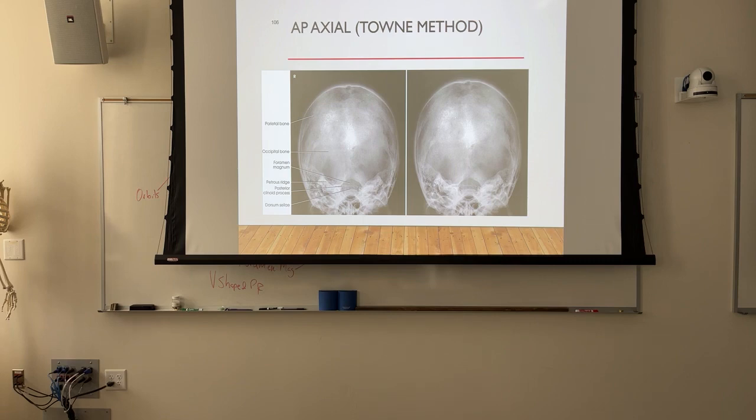Okay, so under pathologic condition or trauma, to show the entire foramen magnum and the caudal angulation, central ray is increased from 40 to 60 degrees. Okay, so look at the images on page 48 and then glance back up here at this. Again, what we have is a little bit more of an oval shape where it's wider than it is long, but if you look on page 48, it's longer than it is wide, right?